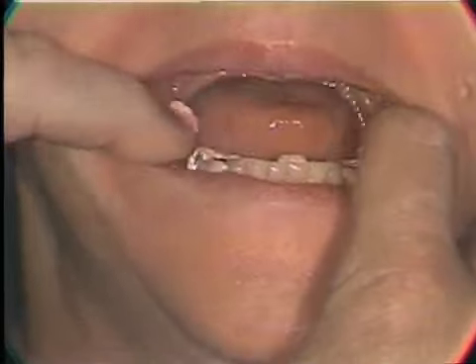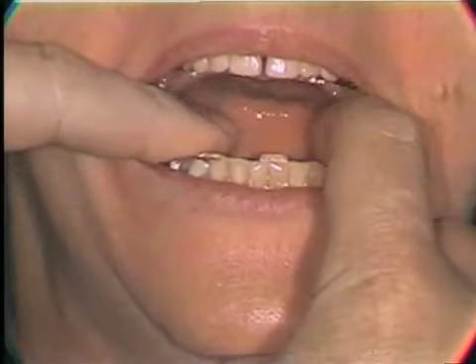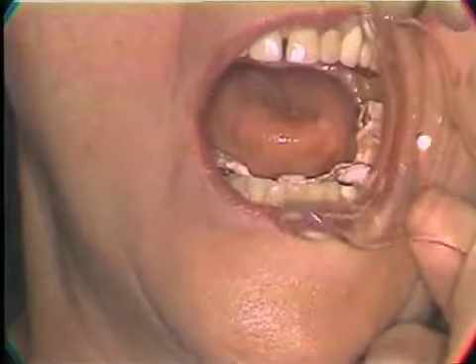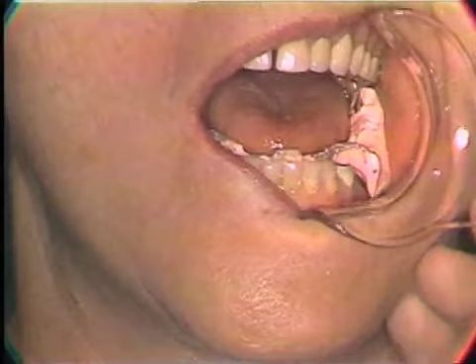Open, please. Would you get the cheek retractors? What we do is we will seat this against the tissue and check for stability of the base. Would you hold this one?